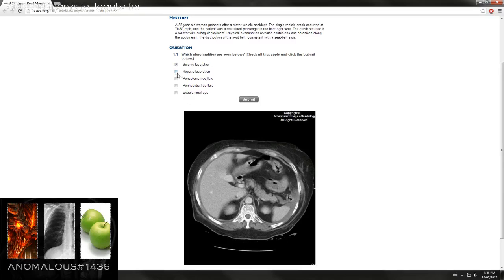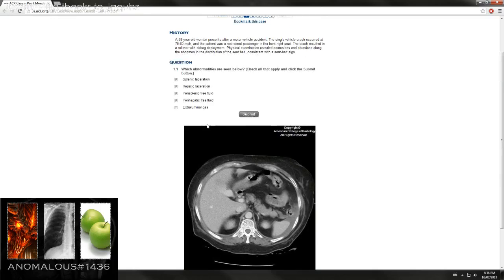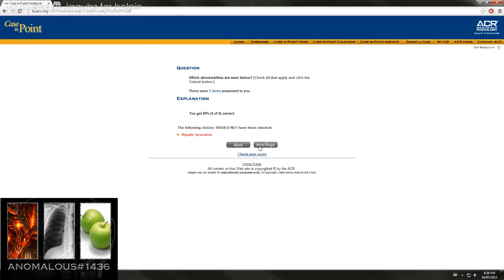I'm just going to have to say almost yes on speculation, but I wouldn't be surprised if it shot me back. I don't see any extraluminal gas at this point. I think everything is intraluminal from what I can tell, and within the bowel, although this is questionable. There wasn't a hepatic laceration, so burned on that.